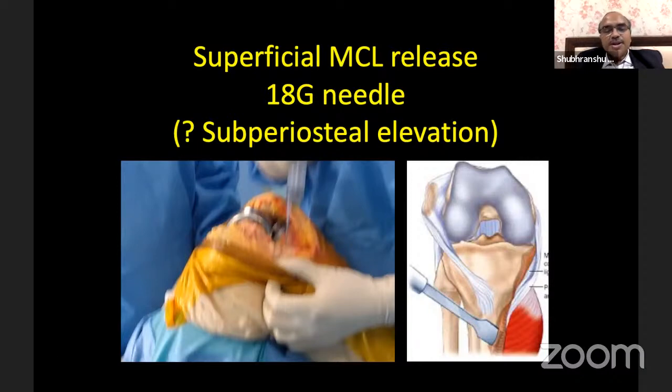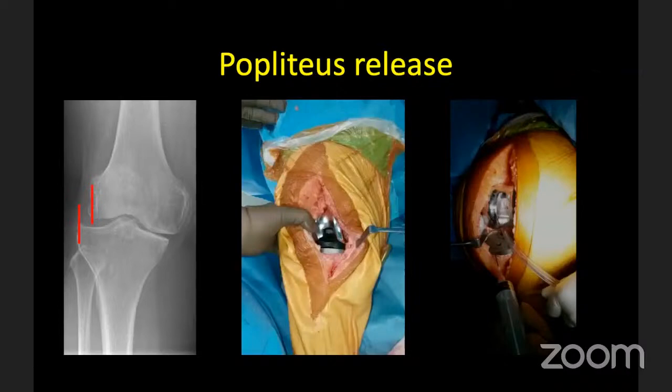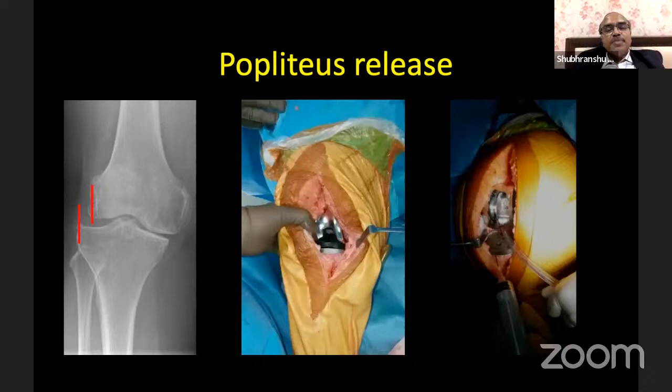Finally, in some cases where there is a mediolateral subluxation, as you can see in this type of case, you can do a popliteus release.